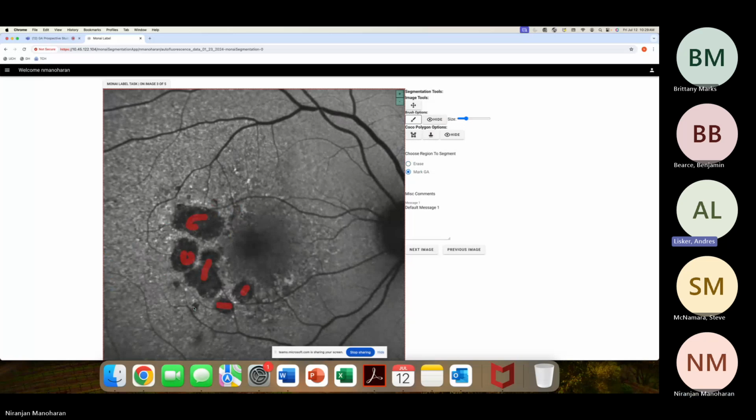Got it. I don't know what you think, NJ. That's exactly what we've been debating back and forth. I think some people are annotating those images, some people are not. I think the consensus is, if you're not sure, don't annotate it, because it should be pretty clear, like these areas where you can see a clear, dark autofluorescent pattern. But these peripheral lesions, especially here, are slightly dark but not very clear. This could be RORA, hard to tell, and I'm sure that it doesn't measure more than 250 microns. So by definition, I don't think that's RORA. So I think it's best not to annotate unless you're sure. Yeah.